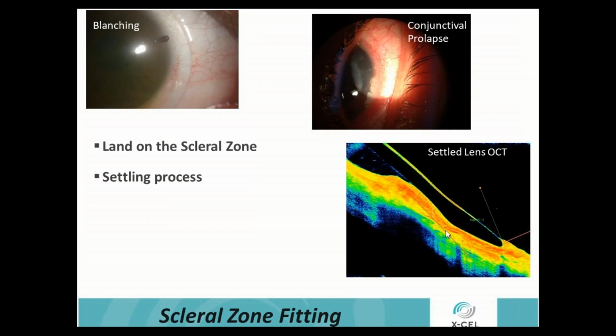And you can see here, here's an OCT, front surface of the lens, edge radius lens, and here's the edge. And you can see that tissue pressing down so much on the edge, it's pushing the tissue underneath up into the limbal area, and the tissue's even coming out over the edge of the lens. So obviously we would need to make a change on that.